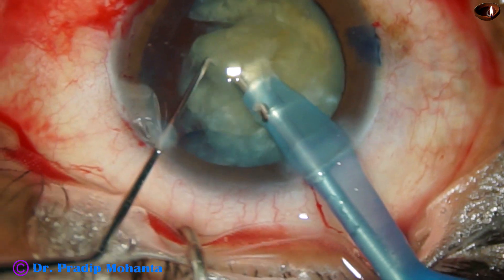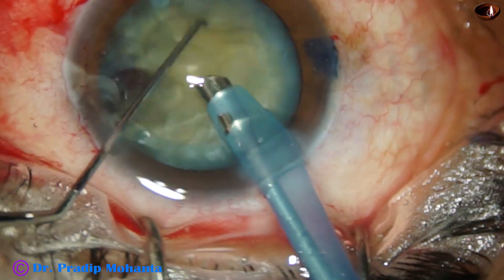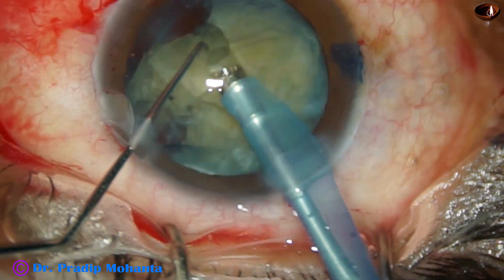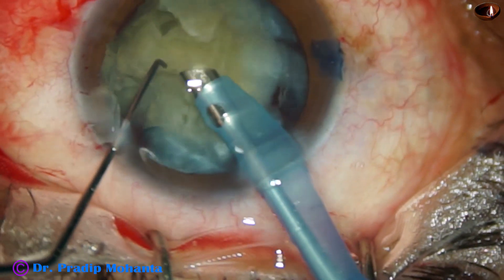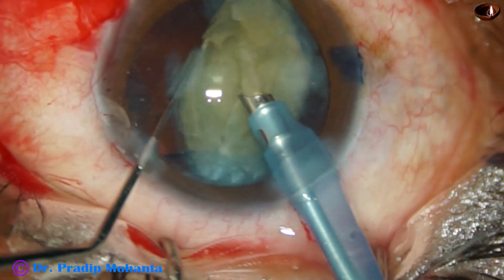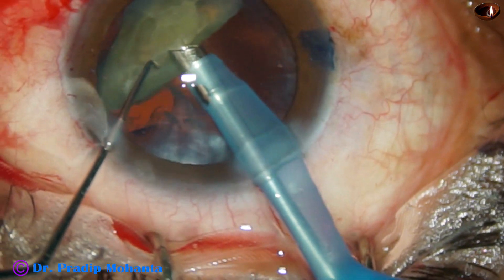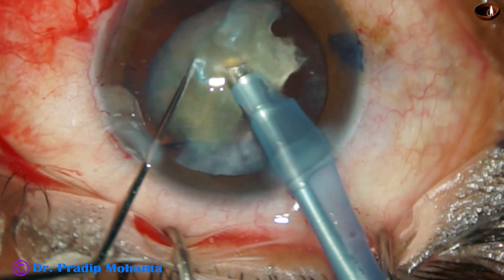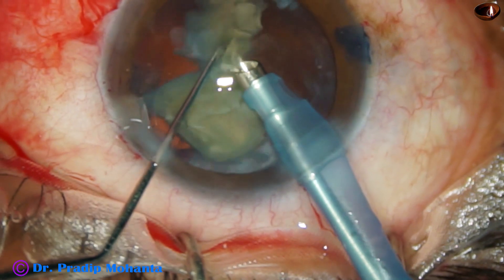I am emulsifying this free nuclear fragment. The nucleus has again gone into the capsular bag, but I am not pressing on the posterior capsule — I am emulsifying just above the iris plane, ensuring a gap between the phaco tip and the corneal endothelium. Since the nucleus was not very hard, I could manage it.